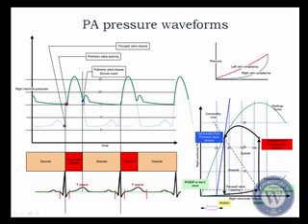One thing that you do note on the pulmonary artery pressure is that you have a dicrotic notch. That dicrotic notch is an indication that systole has ended. That's when the pulmonic valve actually closes. The pressure rebound effect that you see here, and the reason you get this upstroke, is not that more volume is emptying into the pulmonary artery. It's simply that the pulmonary artery has some degree of rebound potential, which means it has an elastic component to it, and it compresses and actually maintains diastolic pressure. So the dicrotic notch is telling you how healthy the pulmonary circulation is, given the rebound elastic qualities that it has.